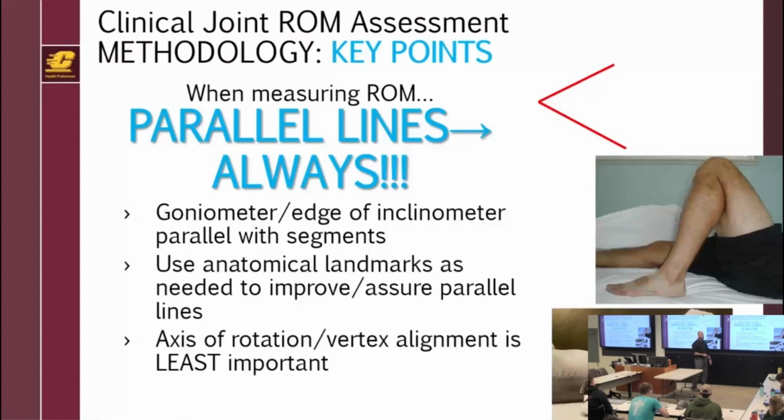Ask for help. Use anatomical landmarks. What's that? I said use anatomical landmarks. You can use anatomical landmarks, absolutely. So let's take this example here, knee flexion.